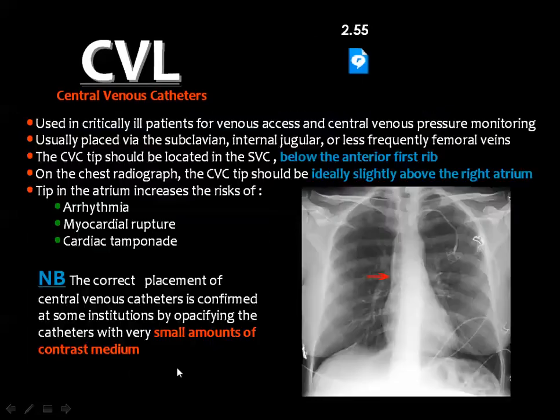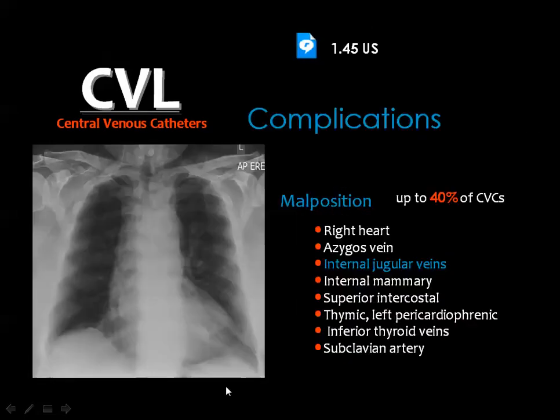One of the policies, if you have the facilities in the X-ray, for example, is to inject some contrast material through the catheter to ensure its accurate position.